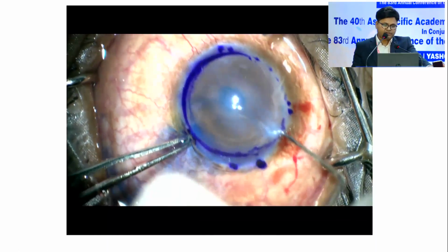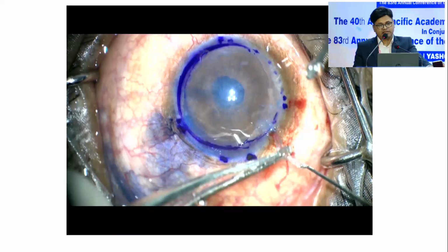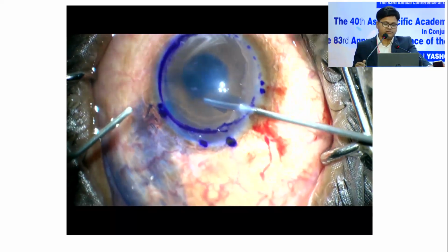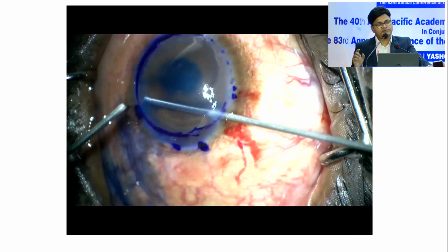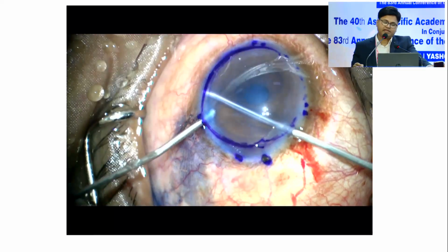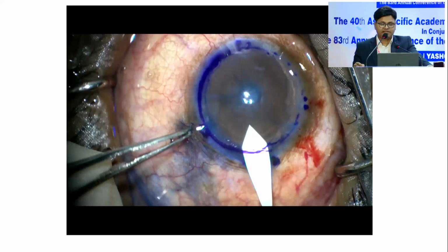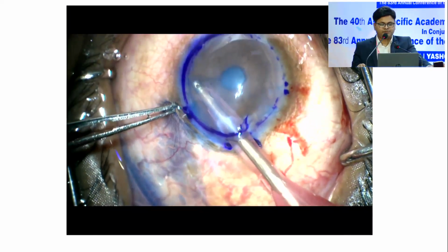And this Descemet scoring is done under Healon. If it is a pseudophakic patient, you can still do it under air, but in a phakic patient, it has to be under Healon cover or else you may hit the lens. PI is a must because these are phakic patients, and once you have scored, then you can take out the Healon with the IA probe.